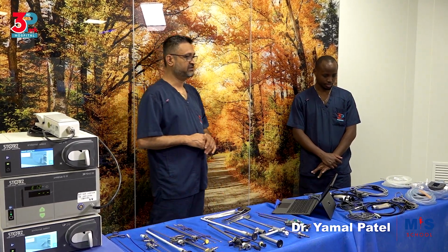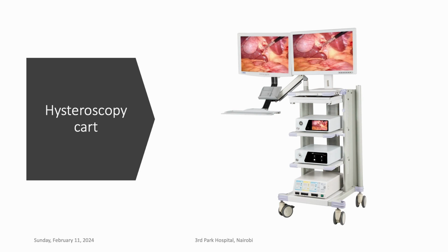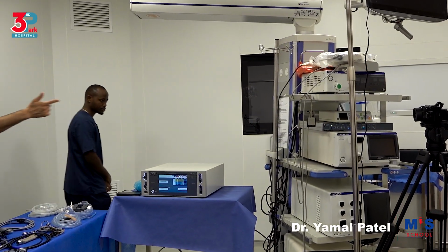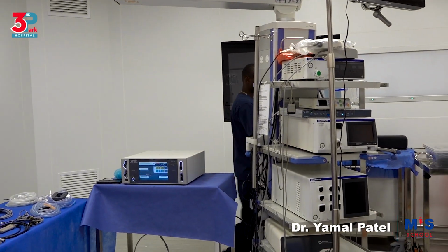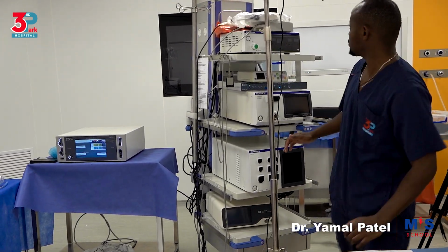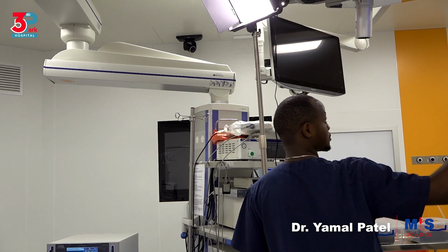Now we start off with the hysteroscopy cart. So let's see this as a cart that is for MIS. Humphrey, if you can just show us the different parts. We'll have the monitor up there. In this one we have monitors on the boom arms.